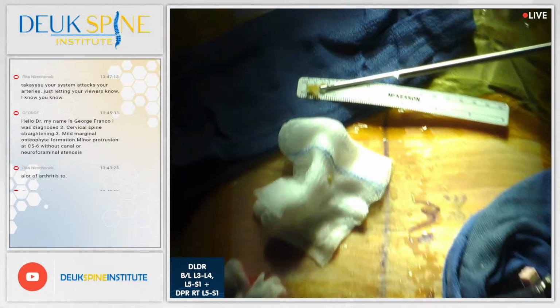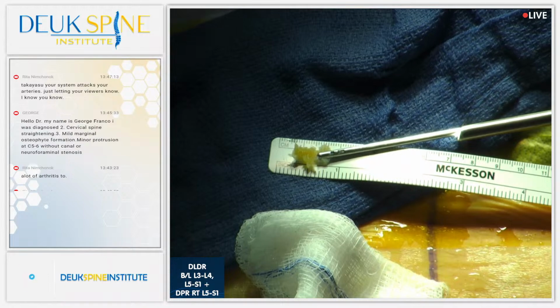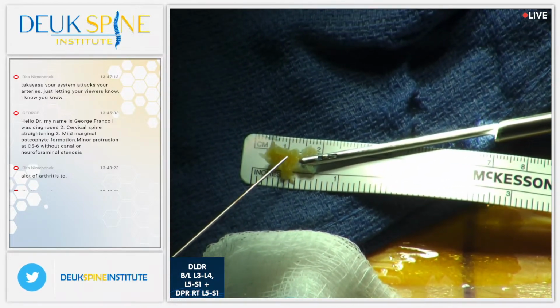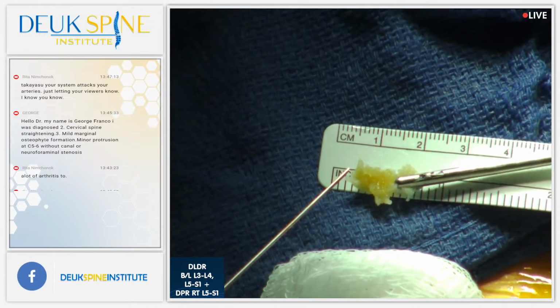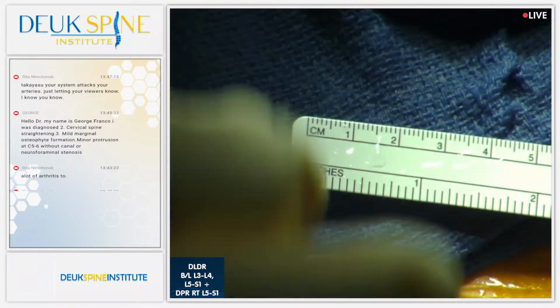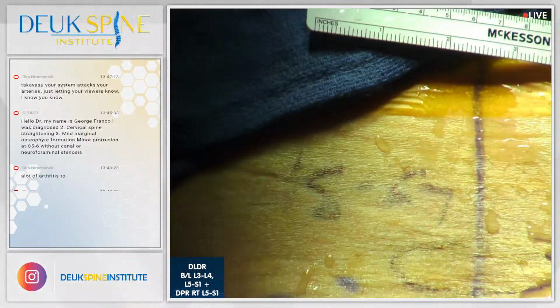Okay, we just pulled this piece of herniation out, and it's a pretty good one. You see the red-brown color? Louise, show them. Yeah. That's inflammation going on in that herniation, your body attacking it. That's evidence of inflammation. So I grabbed it out with the grabber, and we're going to take out a bunch of pieces like that. That's not the only one.